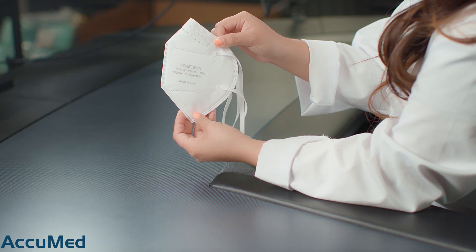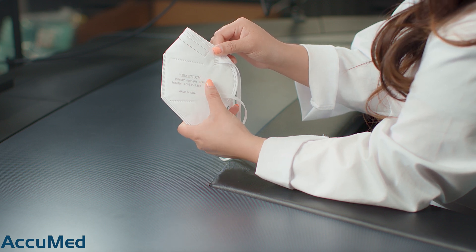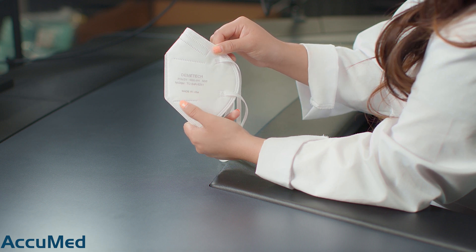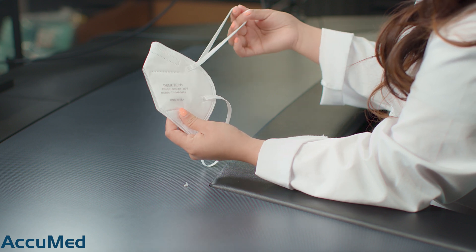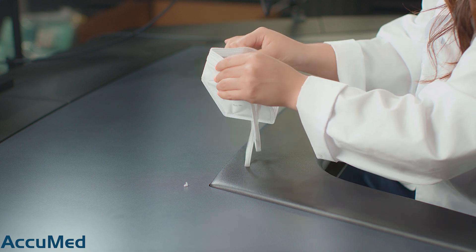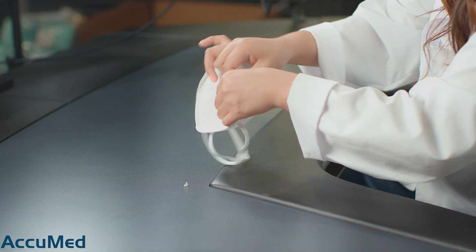I do want to point out that this respirator has all the NIOSH requirements except for the lot number. It comes with the manufacturer name, model, N95 and NIOSH stamp, as well as the TC approval number. These respirators are also made in the US. Looking at the construction quality, these are a little bit on the rough side.